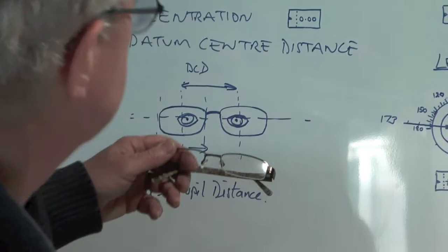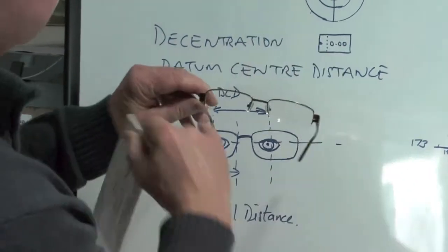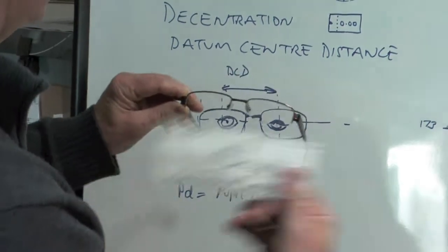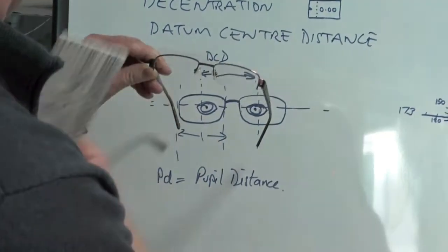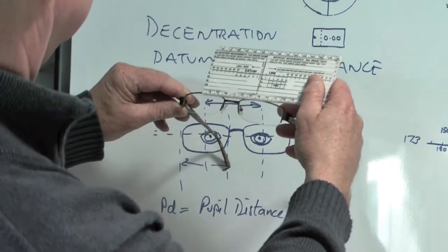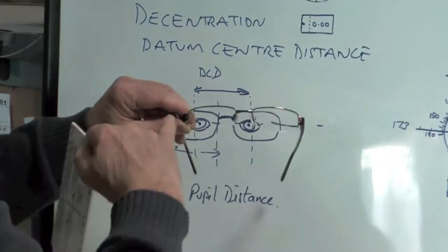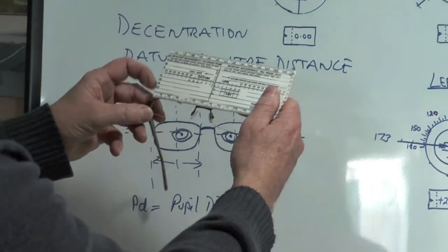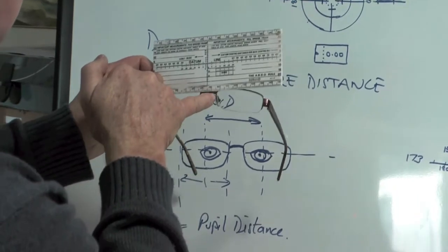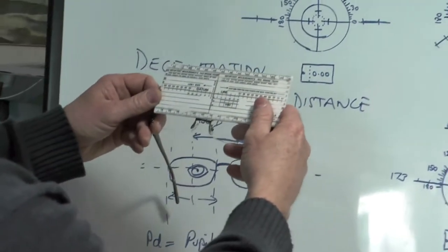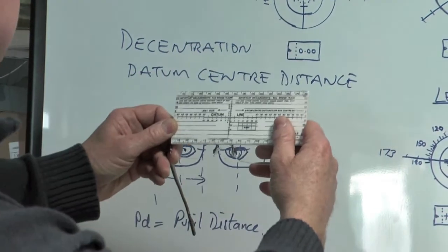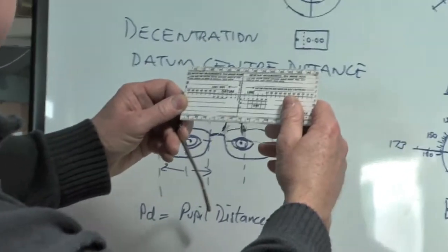We need to measure the distance between the center of this lens and the center of that lens. That's the DCD. Now it's very difficult to do it by guessing. So the best way to do it is to actually hold the ruler to start at the outside edge of one lens and measure it to the inside edge of the other lens. And that will give you a slightly more easier way of measuring it.